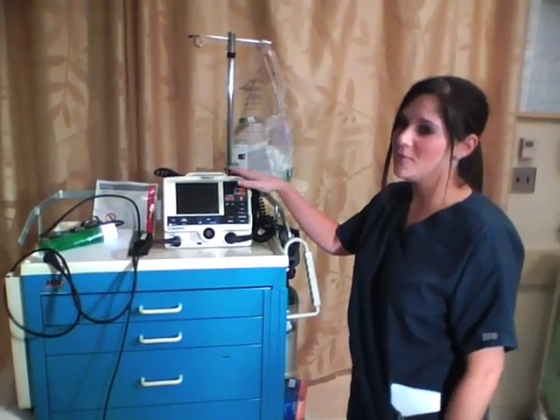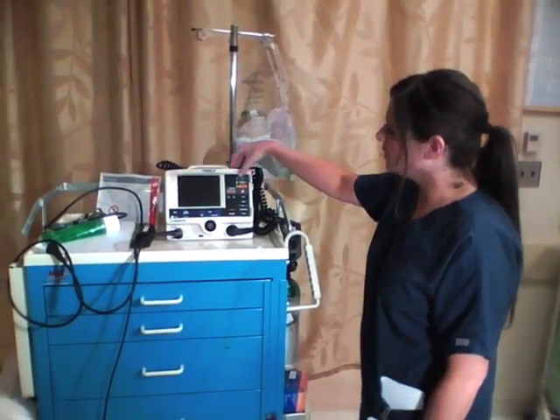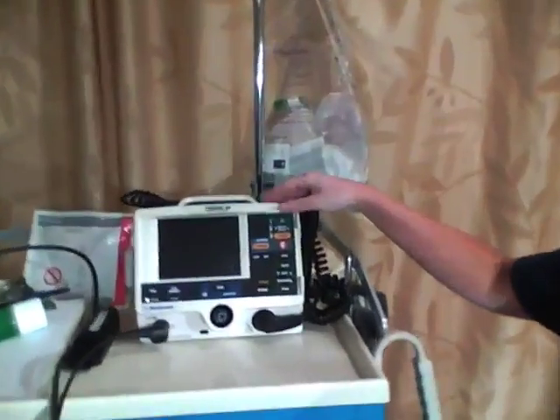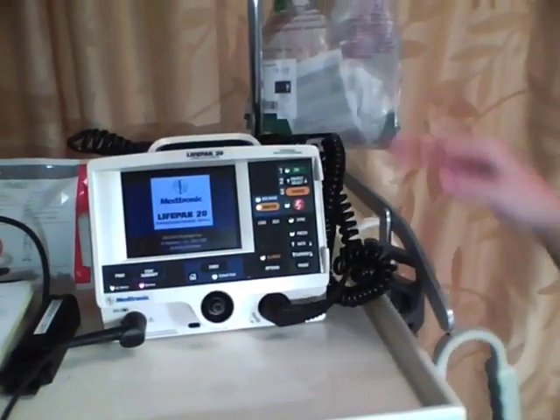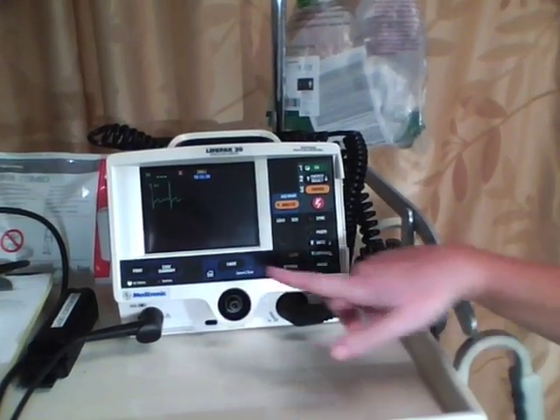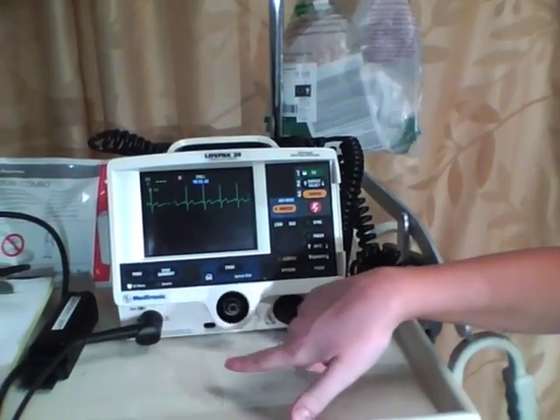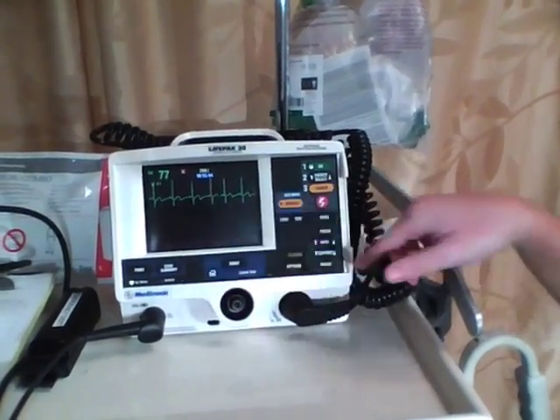First I'm just going to review the monitor, the buttons, and how we set everything up. Green is the power button right here — obviously turn that on. Now we do have a rhythm because we have our leads hooked up to a patient that you're not able to see right now, so you know it's working because we have our rhythm picking up.